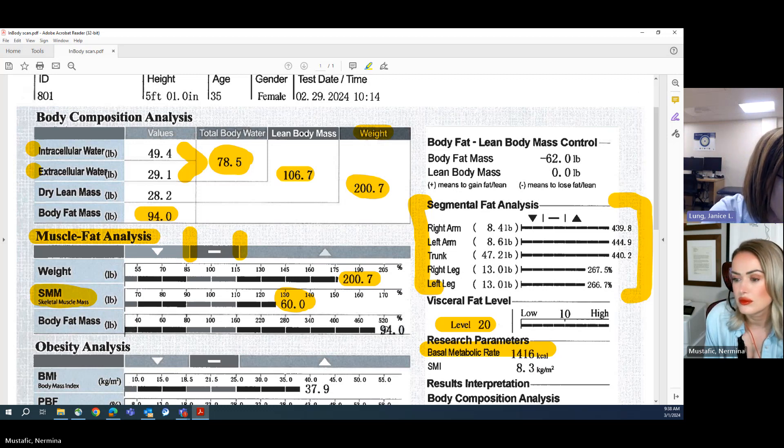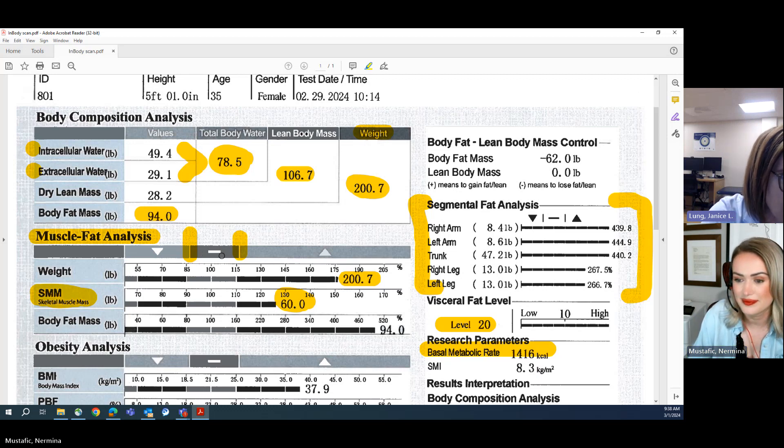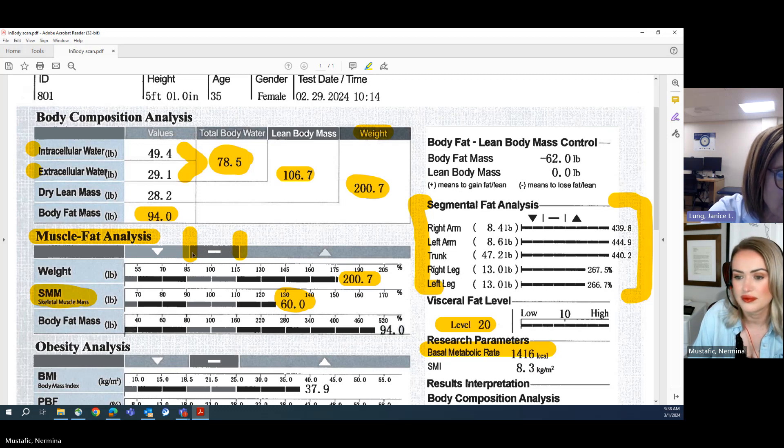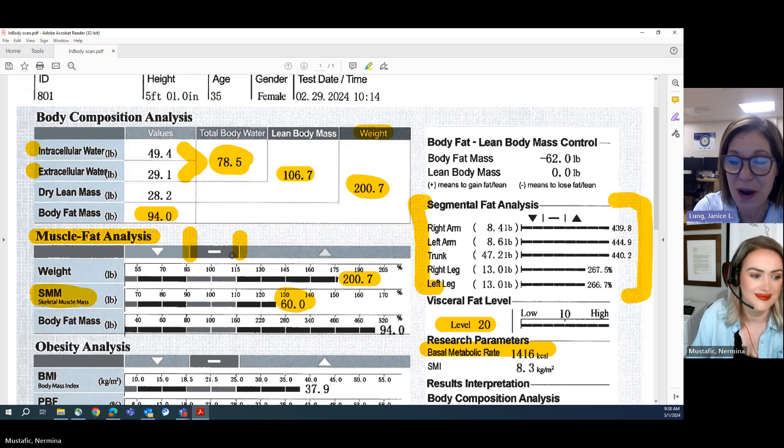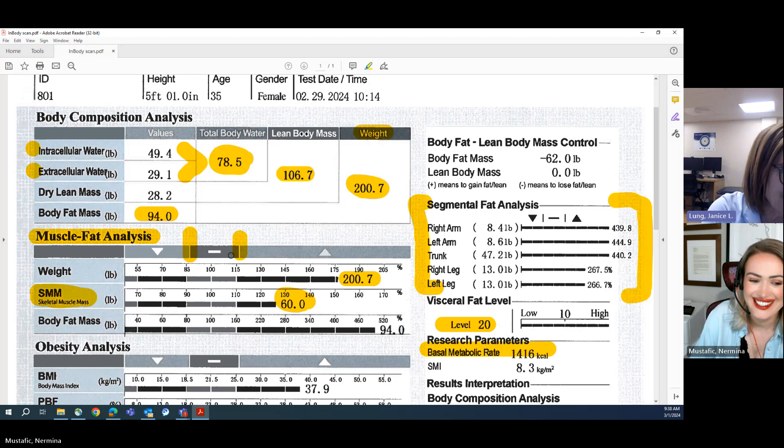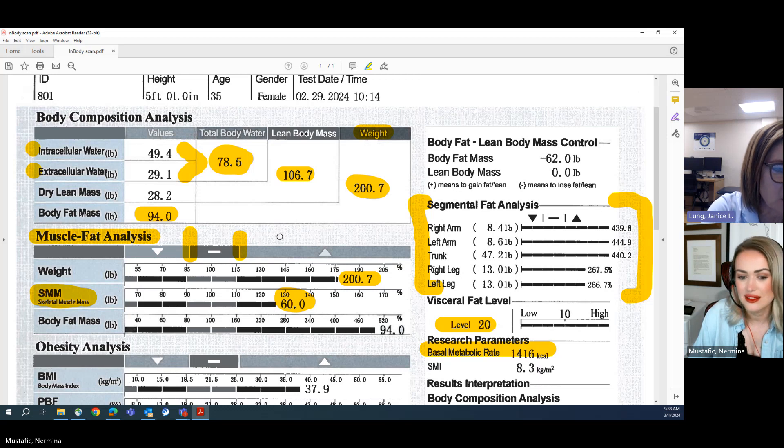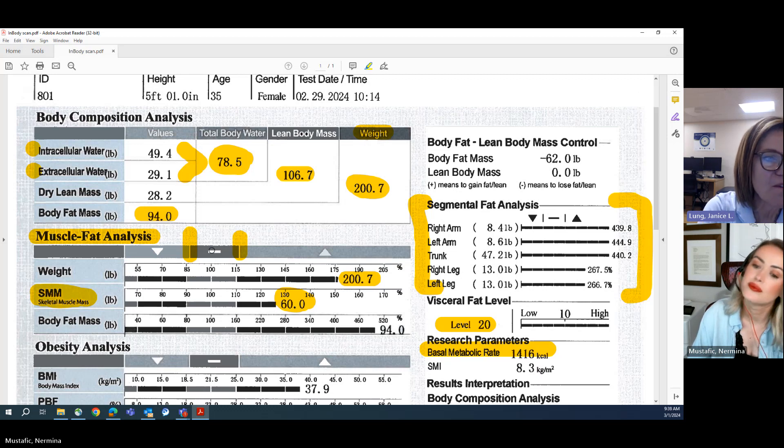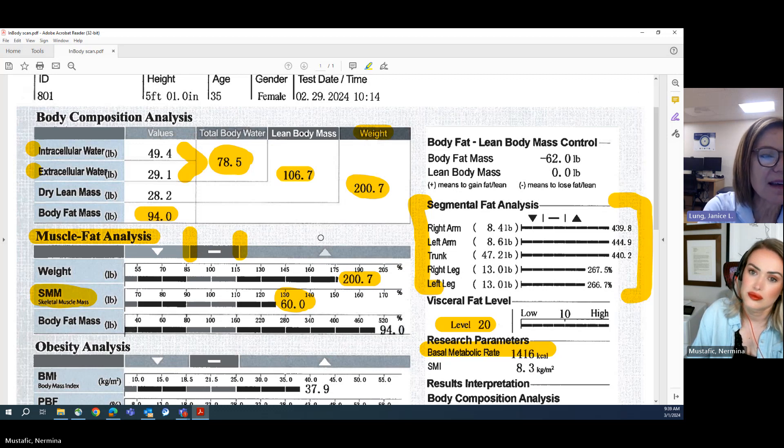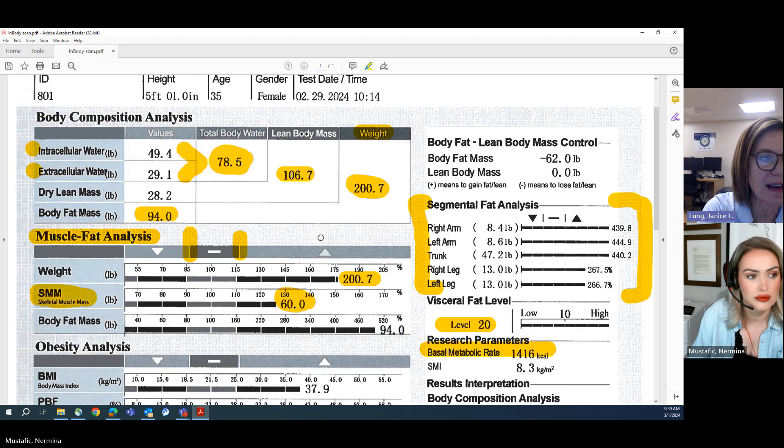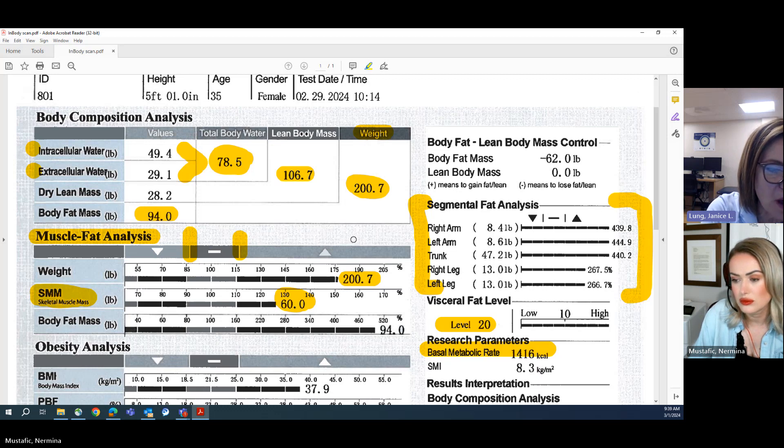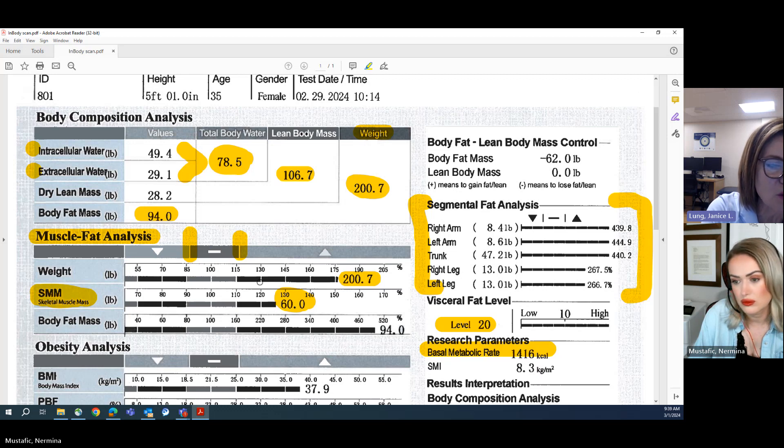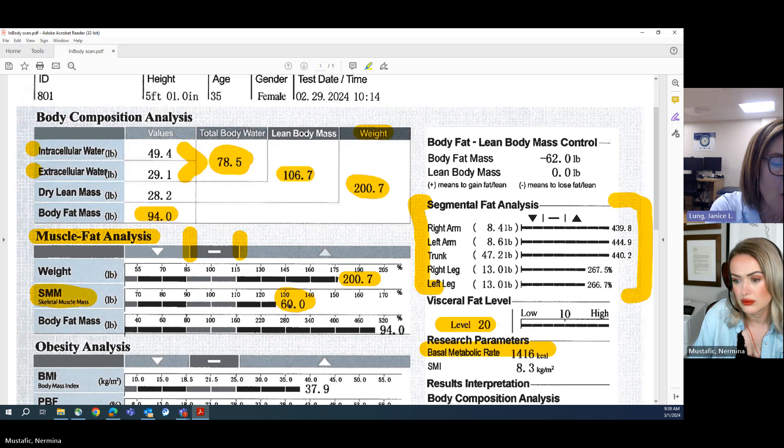I saw that you highlighted that area around that dash. That dash there, it's kind of gray in color, as opposed to being black. That gray in color represents kind of like the normal range, the 100th percentile, not to be confused with 100 pounds, but that 100th percentile and down to the 85th percentile or up to the 115th percentile. So this is the normal range for healthy females of this height. It doesn't matter how old somebody is, but it does matter their gender and it does matter their height. So for most women of five feet one, this weight of 200.7 pounds is outside of that normal range.